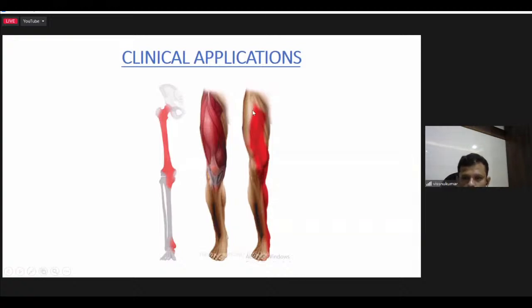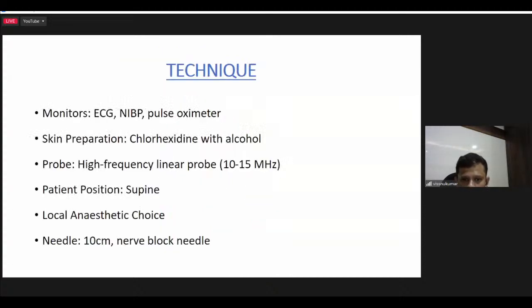Okay. So whenever a plastic surgeon wants to take a split skin graft, always give a femoral nerve block if they are taking a split skin graft in this area. This will give wonderful analgesia, which would not be matched by paracetamol, diclofenac, or tramadol. Okay, this is the dermatome, myotome, and osteotome.